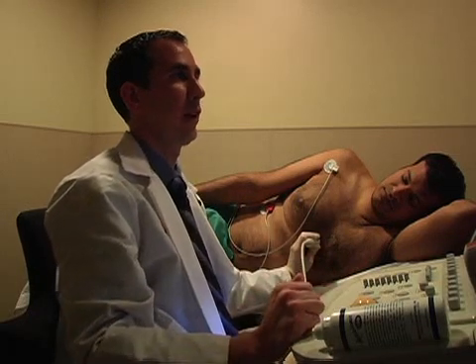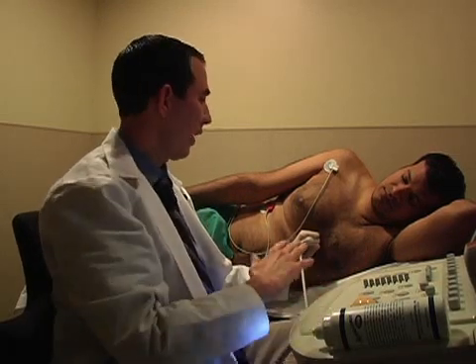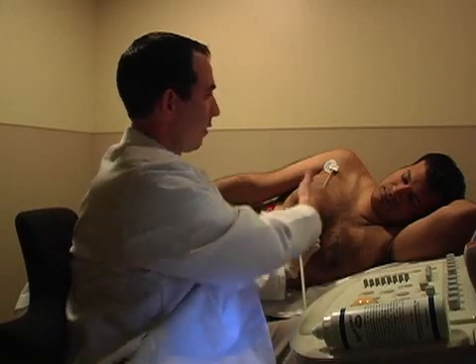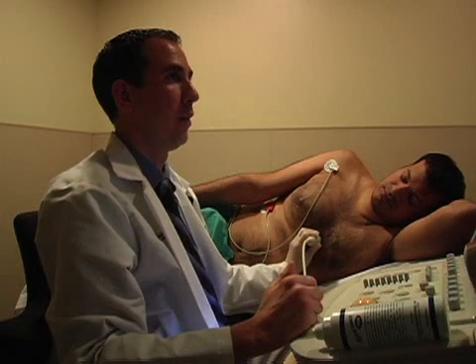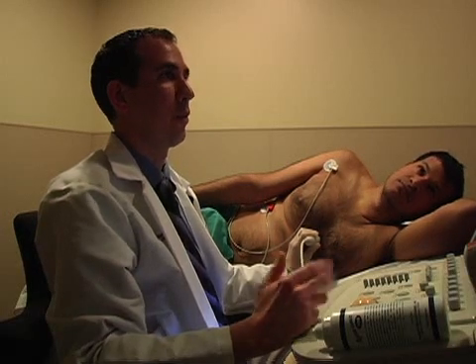That completes the parasternal long axis view. Just to go back to the actual image itself, you always want to make sure the index marker is pointed towards the patient's right shoulder. Sometimes you just rotate a little bit to optimize the image.